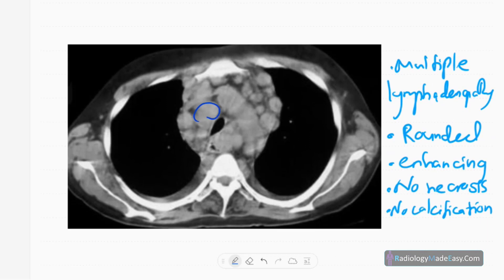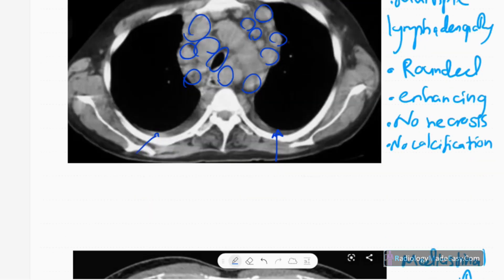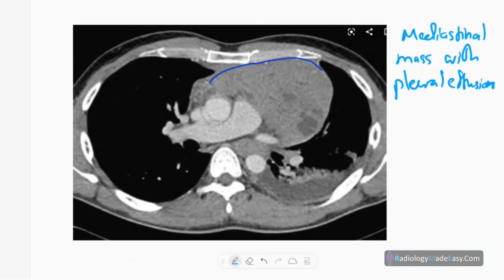In the next CT, there are multiple enhancing rounded lymph nodes in the mediastinum. There are no calcifications or necrosis. If calcification and necrosis are present, you have to think of tuberculosis. Other causes for multiple enlarged nodes include sarcoidosis. You can also see mild bilateral pleural effusions, and the trachea is compressed by the lymphoma.